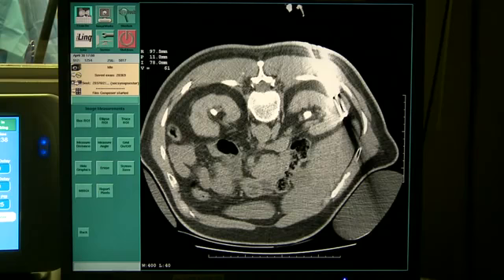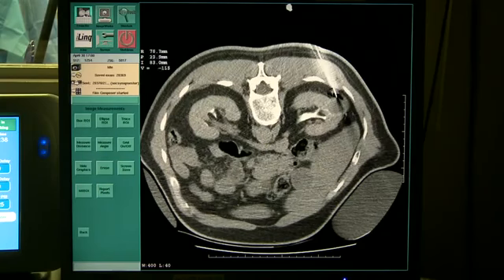I'm not worried about the outer part. And again, I wanted to tell you guys that you don't have to have all your probes parallel, not by any stretch of the imagination. You could come in this direction, taking advantage of the long axis. But the problem with that is you would have ice out to the body wall. One of the issues with planning your ice balls is to realize the length of these ice balls is greater than their width. You know, these are eggs, they're not circles.